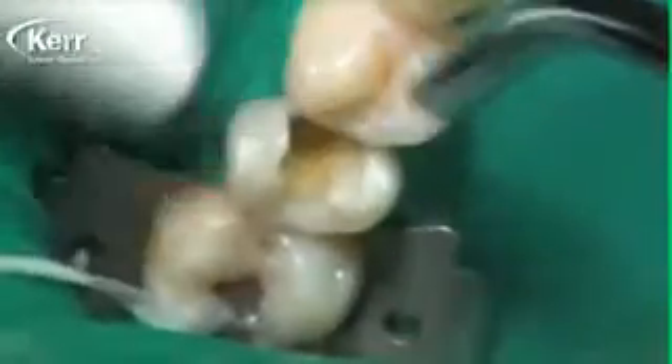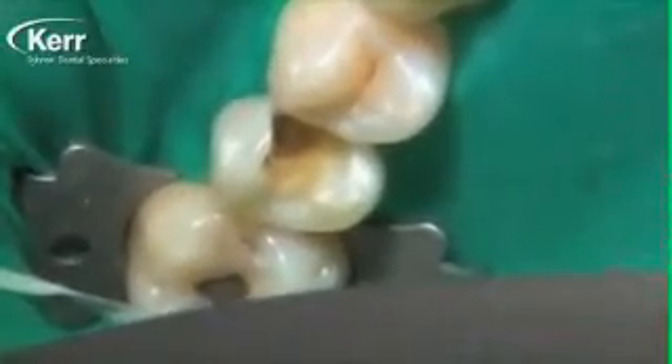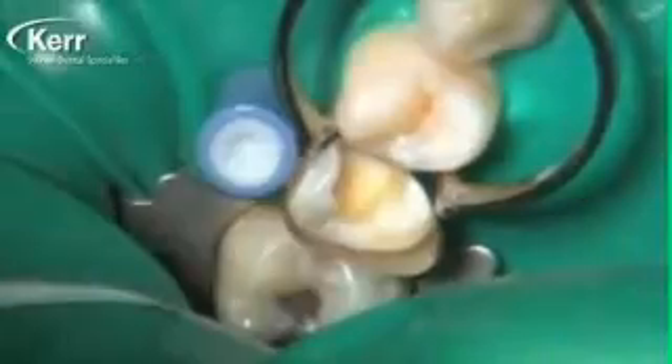Once we finish the preparation, we rinse it off as you see us doing here, and then we dry it for five seconds — hit it with an air blast directly for five seconds and dry the dentin. Dyad Flow bonds well to wet dentin and will bond to moist dentin, but the highest bond strengths we see are actually to dry dentin. It's really nice to tell a dentist: just dry it for five seconds like we used to do with enamel in the old days. It takes all the ambiguity out of what manufacturers mean by moist or wet dentin — just dry the dentin and put the Dyad Flow into place.